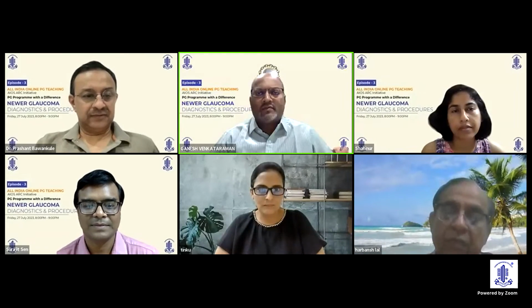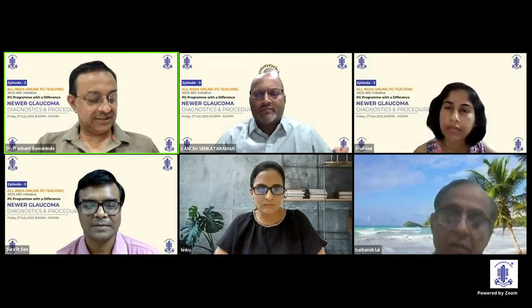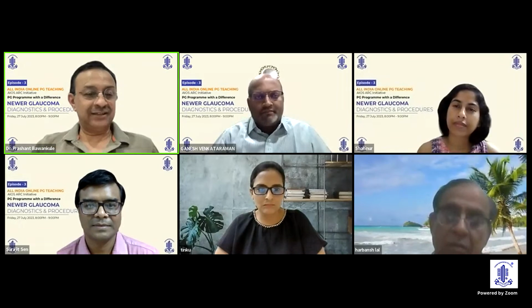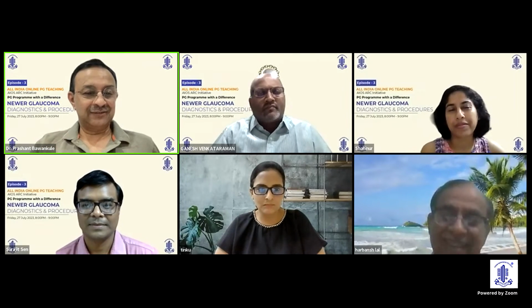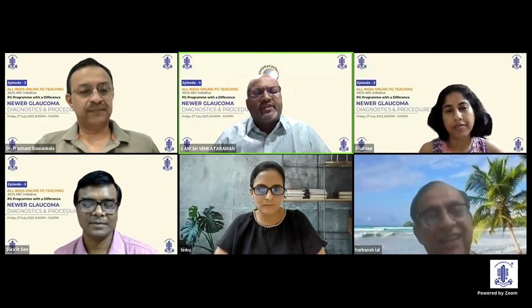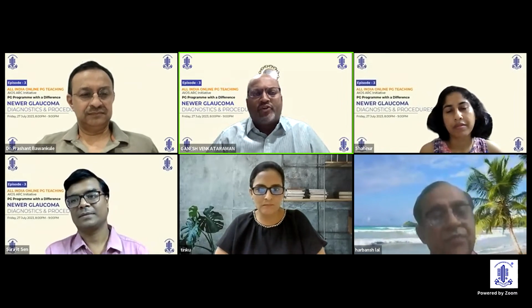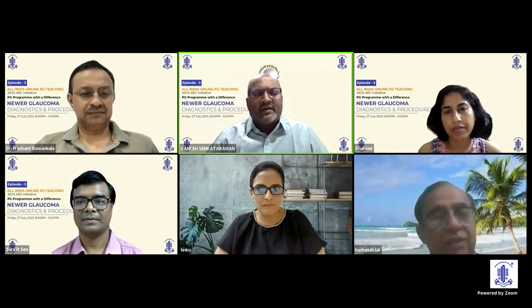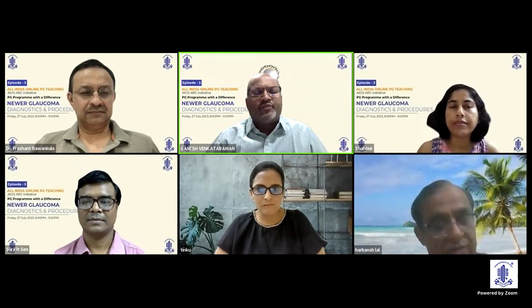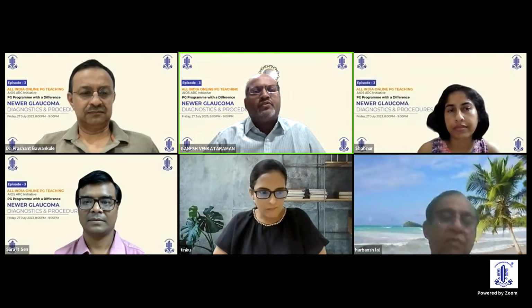Yes, sir. One more question is there. About the non-valved glaucoma devices, sir, he says that previously there were non-valved devices, they moved to valved ones to make it safer. Now, why are you again talking about non-valved development? Yeah, so with the valved device, they go in for something called the hypertensive phase. That hypertensive phase continues to get prolonged over a period of time. There are ways of getting over that hypertensive phase. Some publications have mentioned that you can give post-operative injection mitomycin C. You can give indomethacin or brufen to control the inflammation.